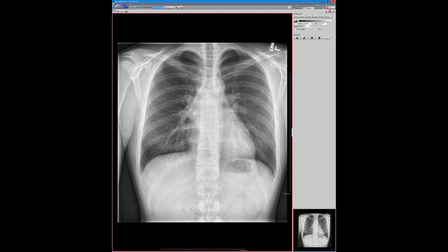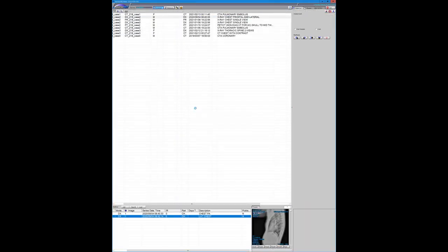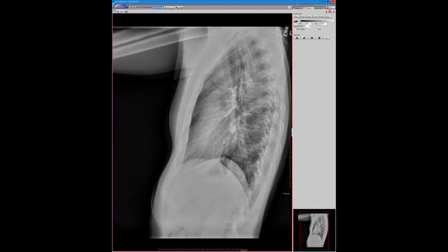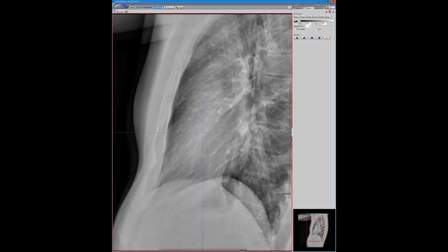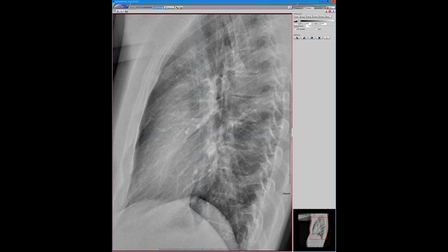Azygoesophageal recess — yeah, exactly. There's an interface there. The weird thing is I don't see it on the lateral. Maybe you guys can point it out to me. I literally can't find it on the lateral. This patient was sent home and came back about four months later with worsening cough.